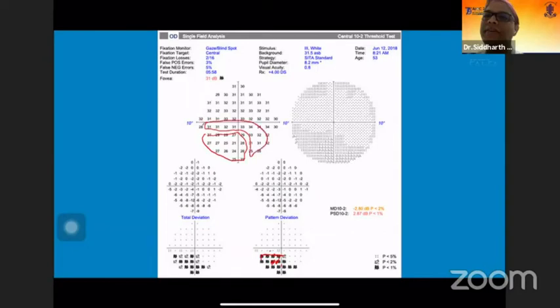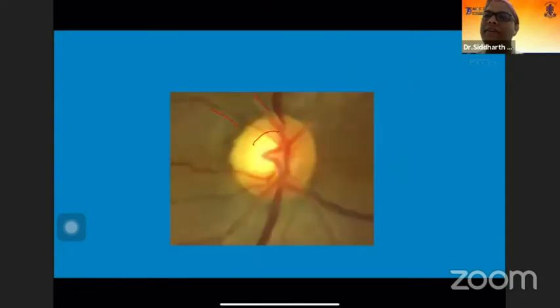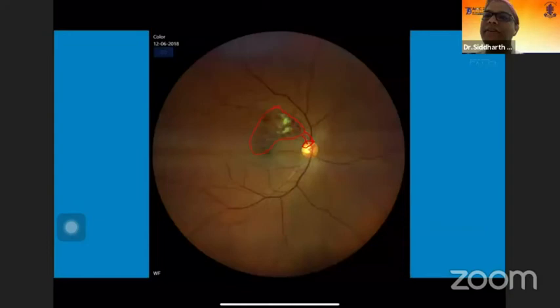Whereas in glaucoma, this would have gone from probably 27, 26, or increased from 27, 29, 31, and increased in various directions. That's a gradual slope, whereas this is a perfect cutout and the straight margins, which can be hints to pick up defects which one might think are not glaucoma.